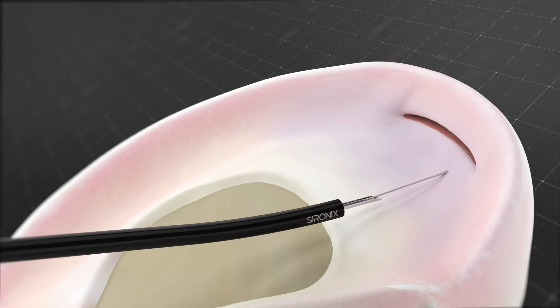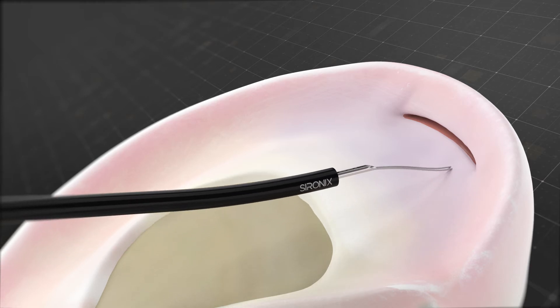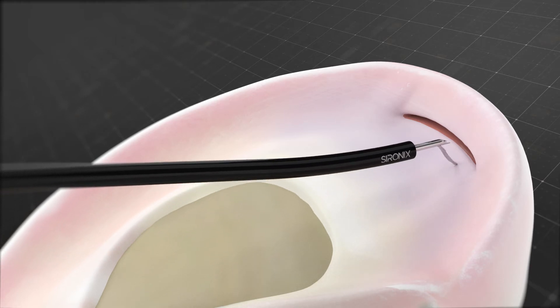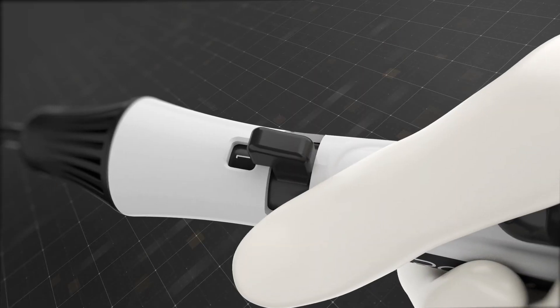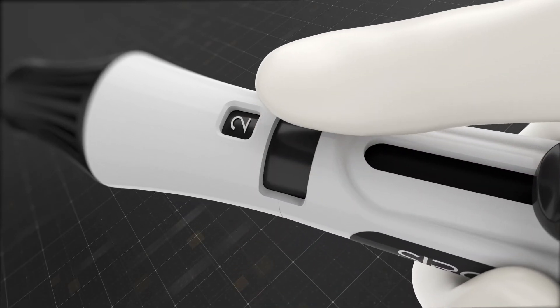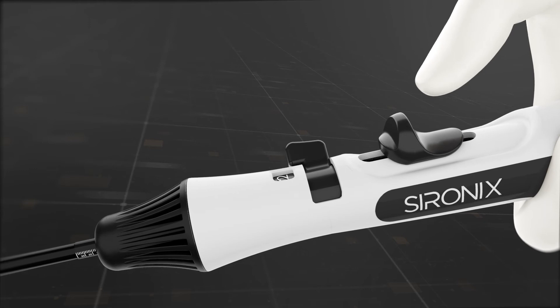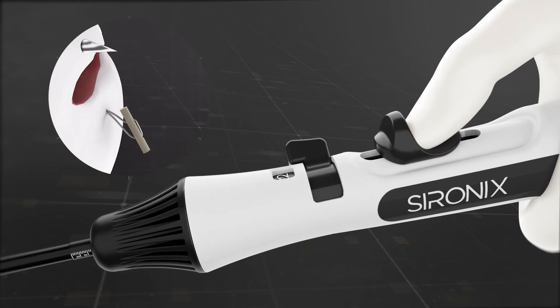To prepare for the second implant, retract the needle and position it at the next desired point until the depth control tube touches the meniscus. Then turn the safety knob to active position two and advance the implant using the deployment knob until there's an audible click.